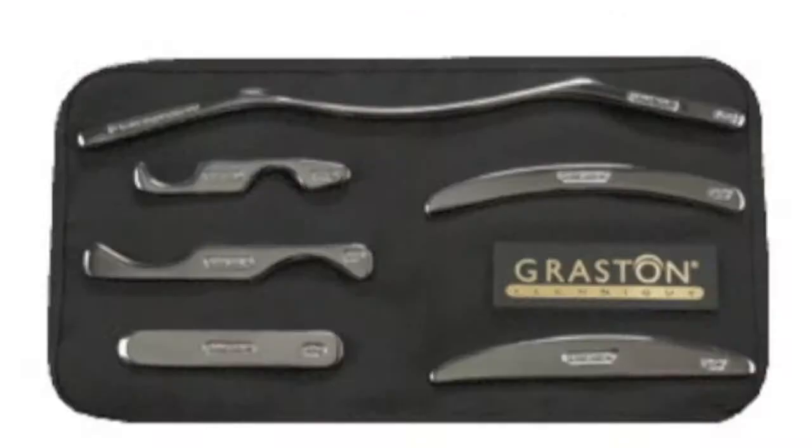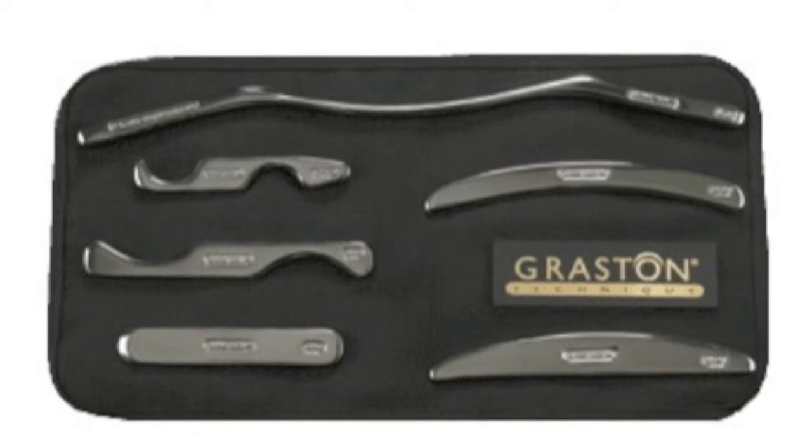The six stainless steel instruments consist of concave and convex shapes to mold the instruments to various contours of the body. This design allows for ease of treatment, minimal stress to the clinician's hands, and maximum tissue penetration for the patient.